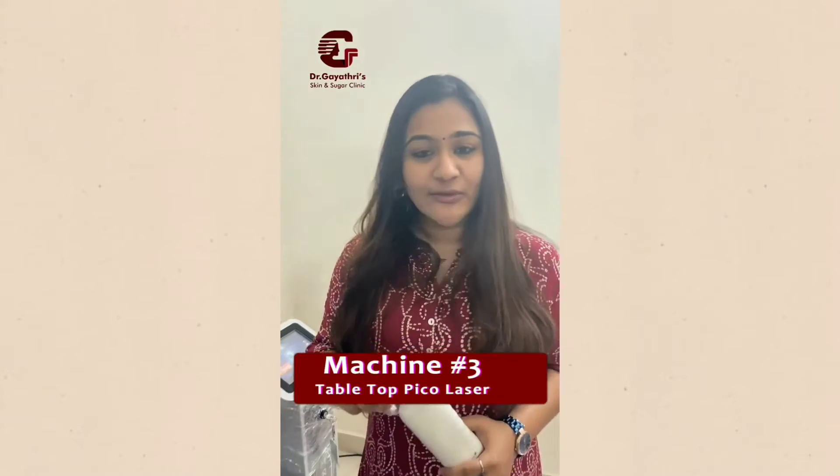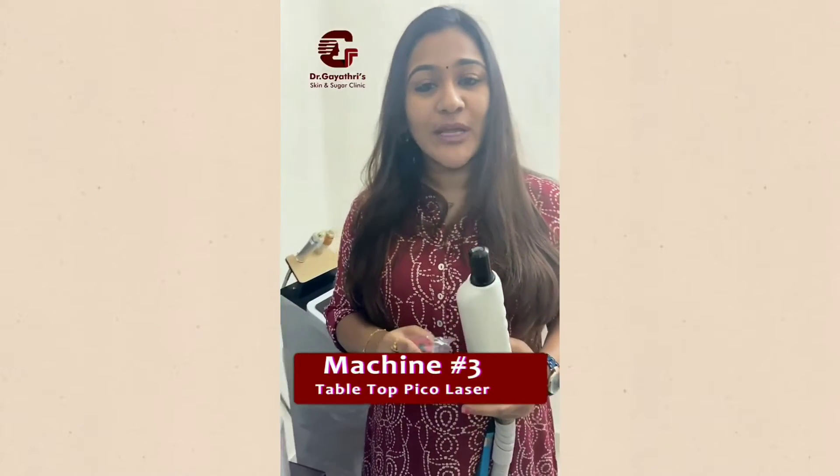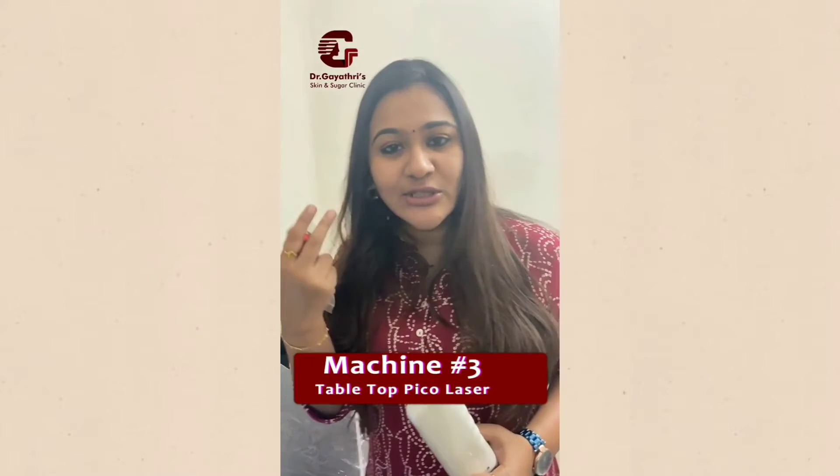This is basically the filter for the carbon laser beam. Then we have the 1064 filter, which primarily is used for any sort of pigment disorders like freckles, lentigines, or nevi. That is how it is used.